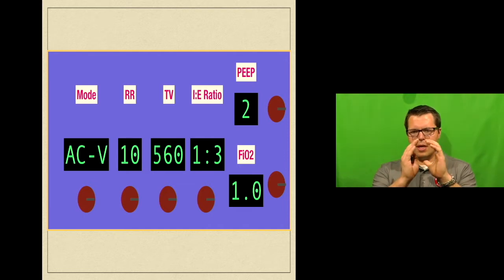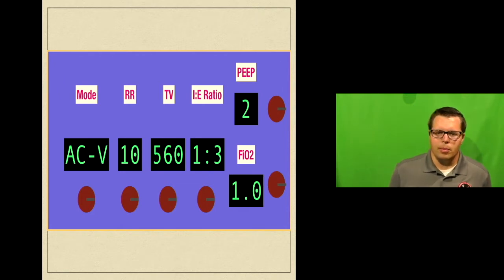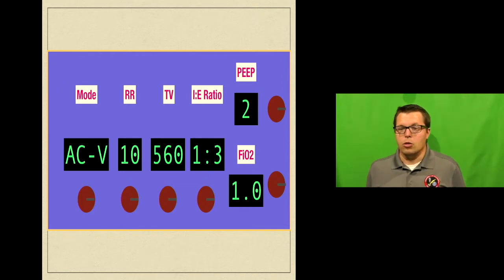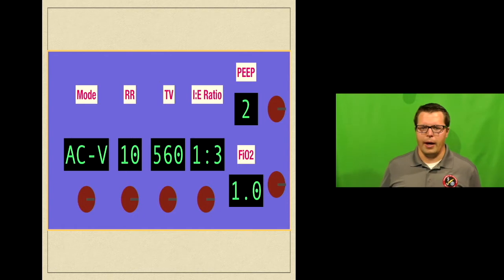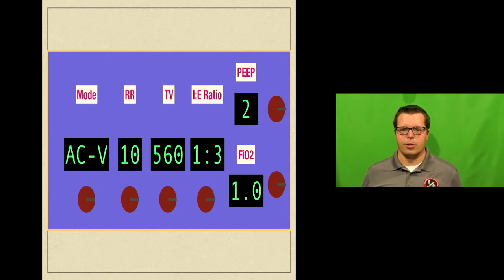So if you continue to keep those things open, you can have better gas exchange with it. So I'm going to put all these people at a PEEP of somewhere between 2 and 5, at least to start off with, and sort of evaluate till I know better. I don't think a 0 PEEP is a great idea in these folks. So at least 2, if not a little bit higher, and it will be a little bit beneficial for the patient.